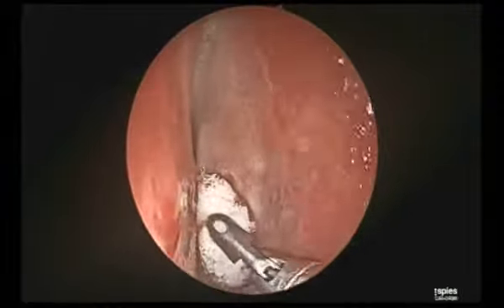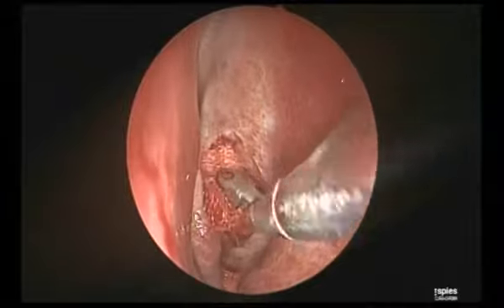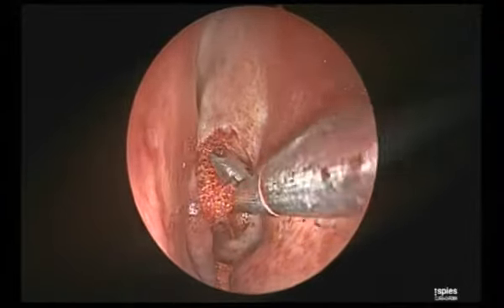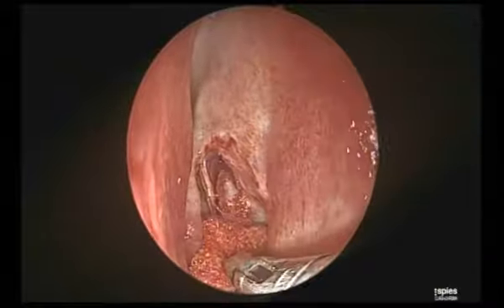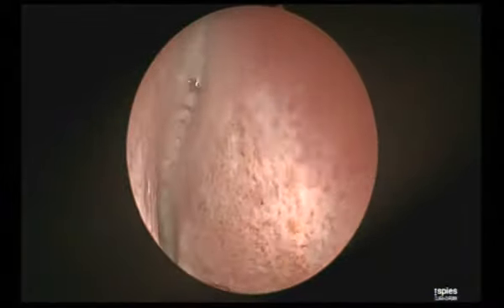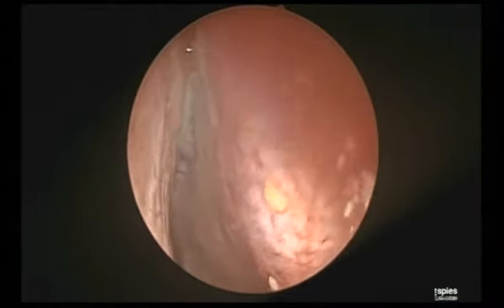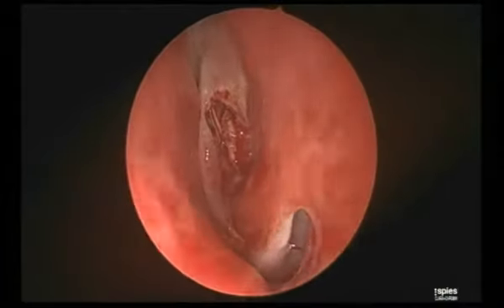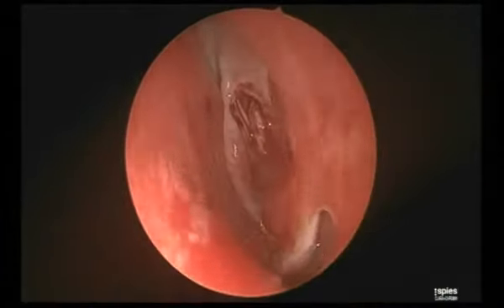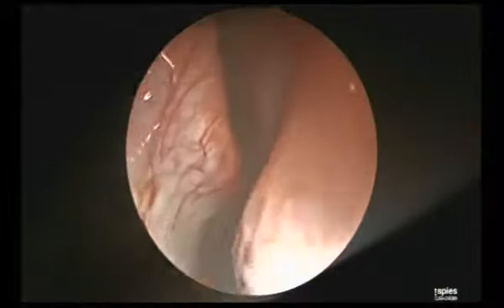Of course, for the junior colleagues, you need to get used to this 70-degree telescope, because optical distortion is something which you need to overcome by getting used to it. That's, I would say, a learning curve. But see why I said versatile. If I make it horizontal, you can make it even 120 degrees. See the entire roof of the anterior nasal cavity, anterior most. But if I make it vertical, can you see this picture? I can make it 0 degree as well. I can go into the nasopharynx anywhere and make it 0 degree. So this is the most versatile scope, I would say, in my practice.